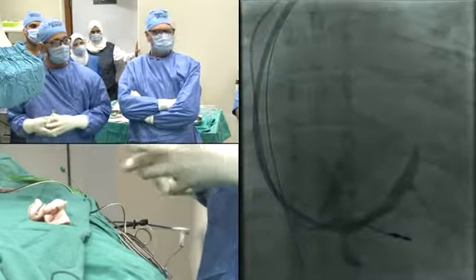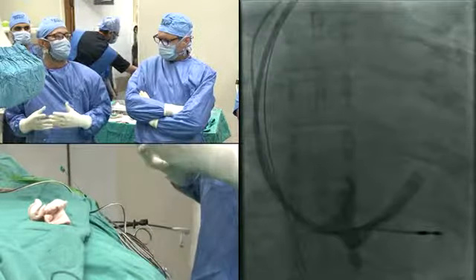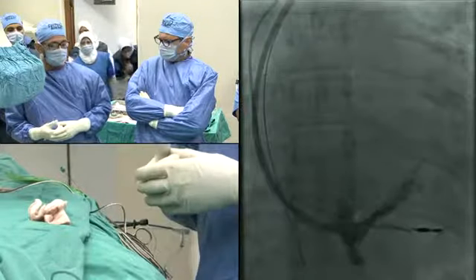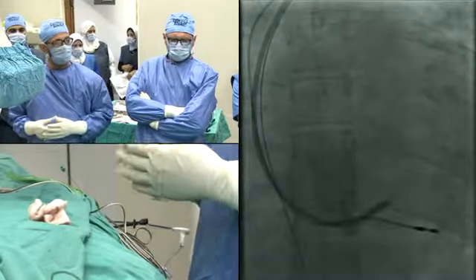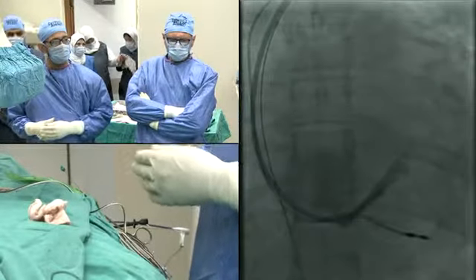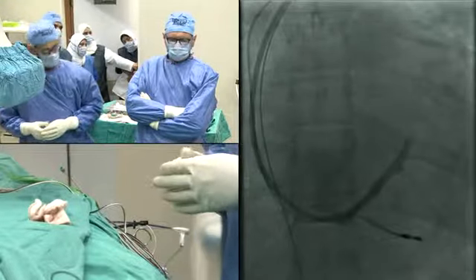It makes a better angiogram, but it's not necessary, because it is safer not to inflate a balloon inside the coronary sinus if we can avoid it. So we tried the direct injection, and it reveals two very good branches in the posterior and posterolateral positions, and we are going to target these branches.